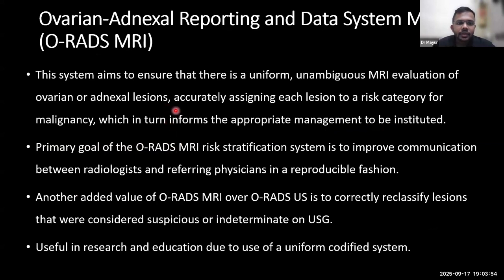It is a system to ensure a uniform and unambiguous MRI evaluation of adnexal lesions, assigning each lesion a risk category score, which will inform the physician about the appropriate management to be followed. The primary goal is risk stratification and improving communication between radiologists and physicians. Another advantage of MRI O-RADS over ultrasound O-RADS is that it can reclassify lesions labeled as suspicious or indeterminate on USG. It is also useful for research and education because it has a uniform way of reporting.